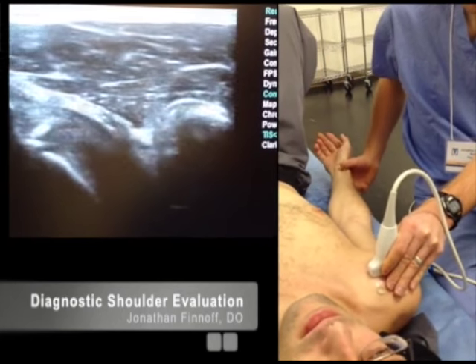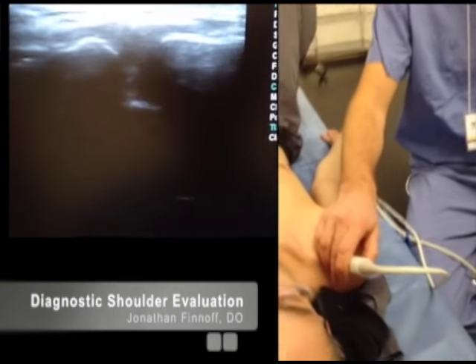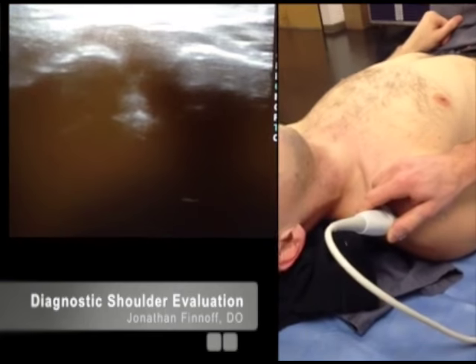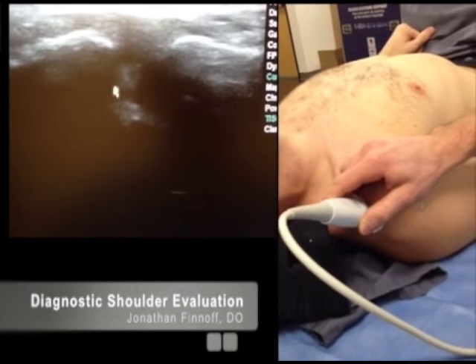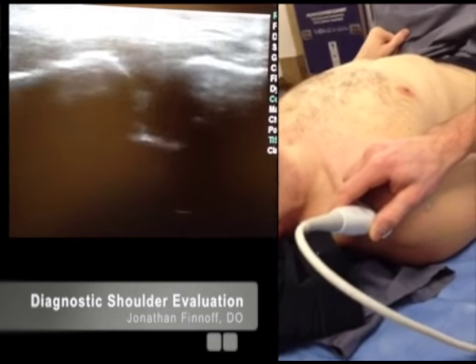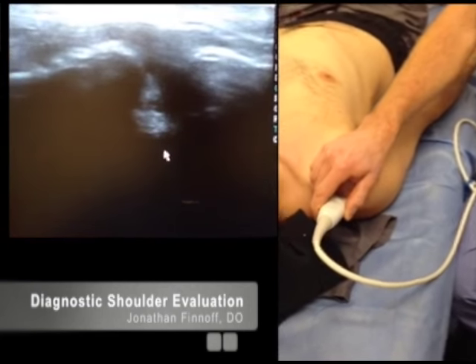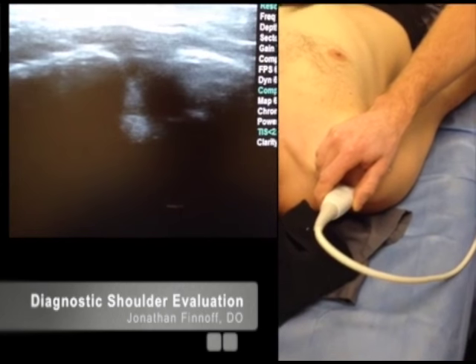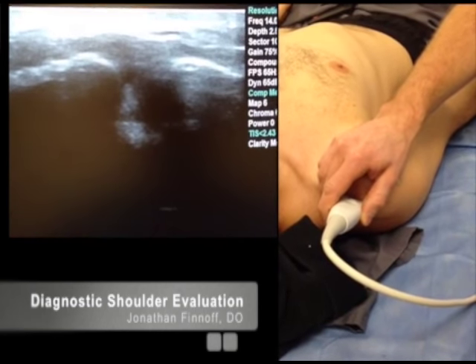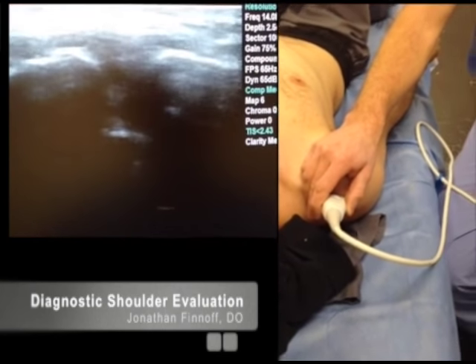After looking at that region, I'm going to glide my transducer up cephalad all the way to the AC joint. Here's the AC joint — I'll adjust depth. Lateral is on the left of the screen, medial is on the right, and the AC joint is in the center. I'll scan posteriorly and anteriorly to get the entire extent of the AC joint. His does not have significant osteoarthritis, distal clavicular osteolysis, or other pathology. You can do traction on the arm to look for instability from an AC joint separation, or you can do a scarf sign — active maneuvers while looking at the AC joint.